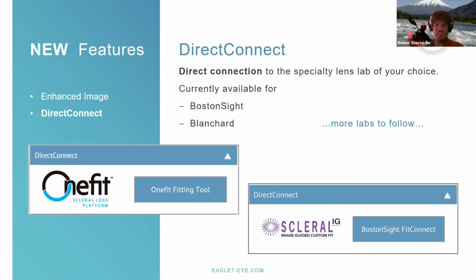Are there more questions? I have my PowerPoint open, so I cannot see what's written. Well, one more quick question. Once we have the new 5.0 software, will we still be able to look at images? I understand first lens fit will not work, but will we still be able to look at the images and see the scleral profile? Yes. All your old images stay the same way as they were. Okay, perfect. Thank you.